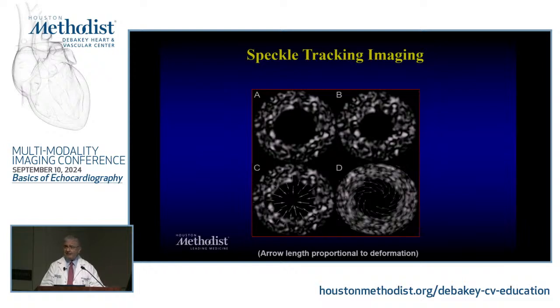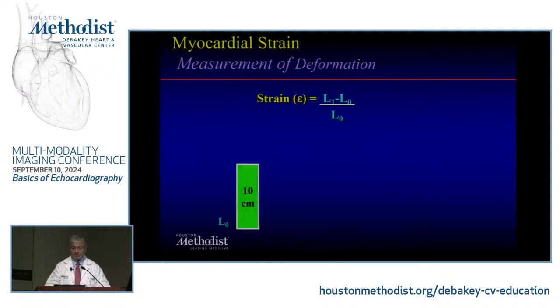Then speckle tracking came, right? It's almost 20 plus years ago now. It's amazing. I was at the first presentation. I was blown away that actually you could track these speckles of ultrasound, which is the nice thing about it, is angle independent. And that's where you come to measuring strain, etc.